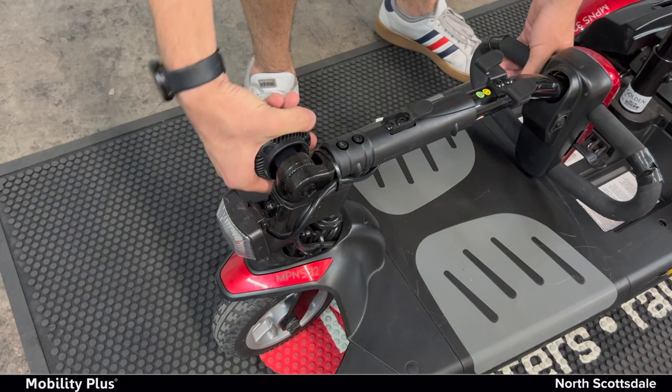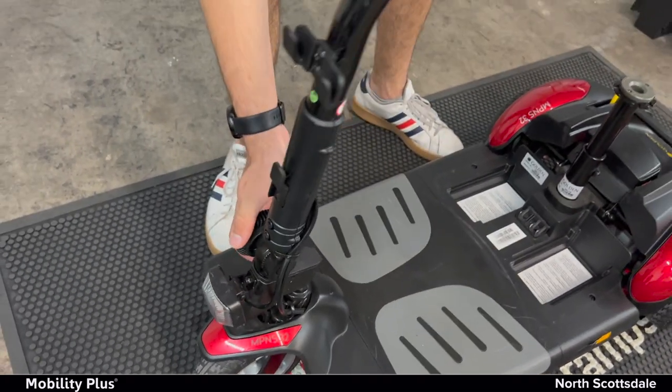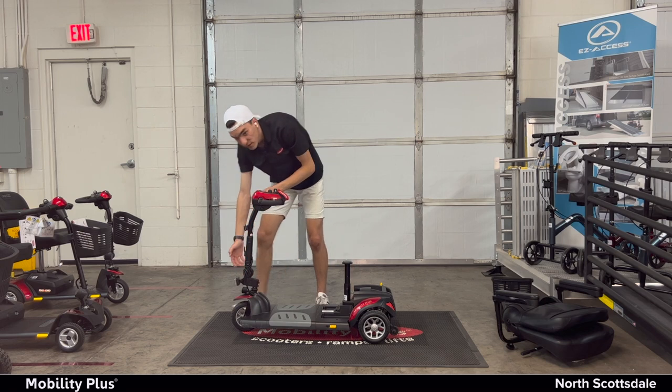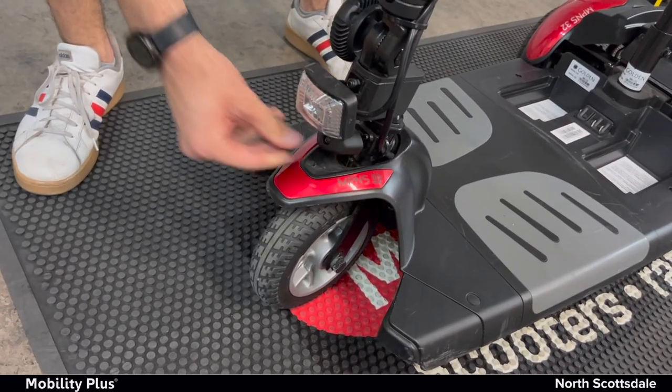Loosen the tiller again, pull it up, and then tighten it so it doesn't move back and forth. Loosen this again — just tap it, push it in and turn it.